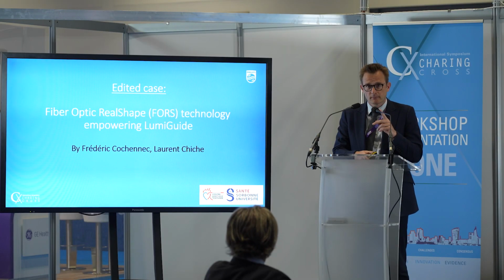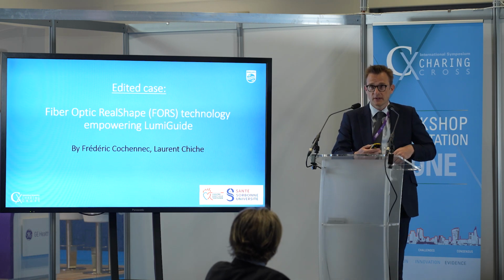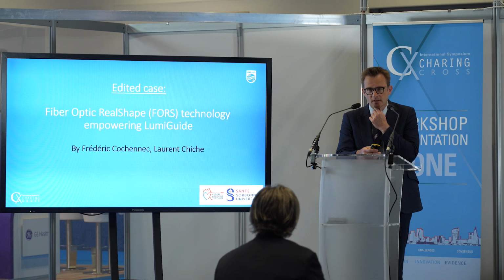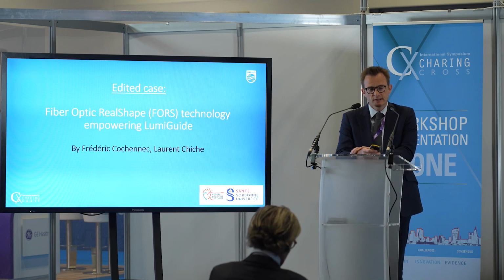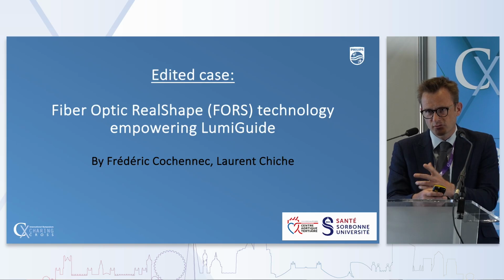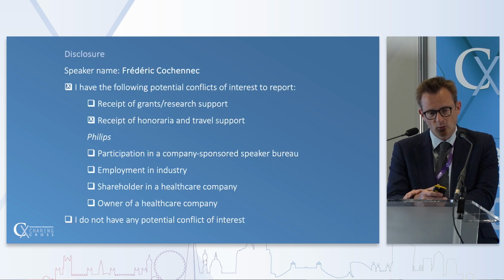Hello everybody. I'm glad to be here and to talk about the FORS technology, and my task today is to show you an edited case I thought was quite interesting because it gives you insight into the way this technology is able to reduce radiation, but also to help you during the navigation phase in the aorta.